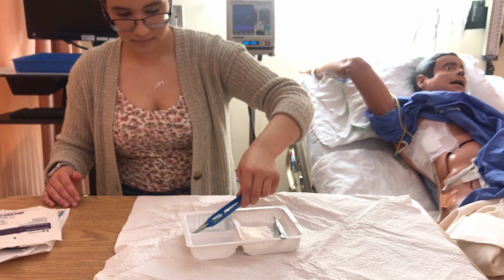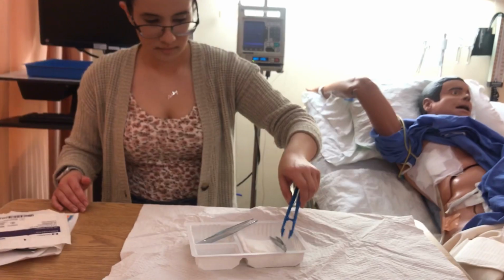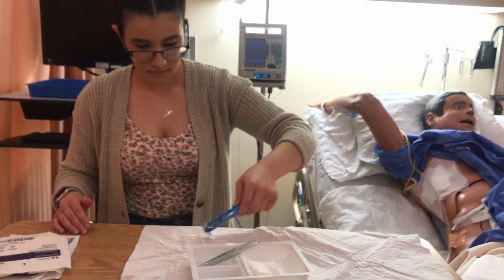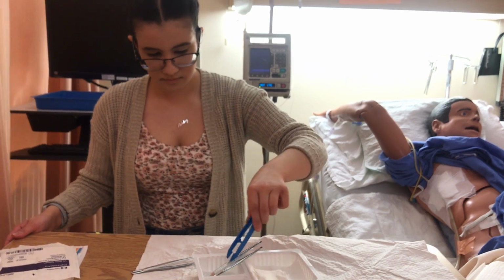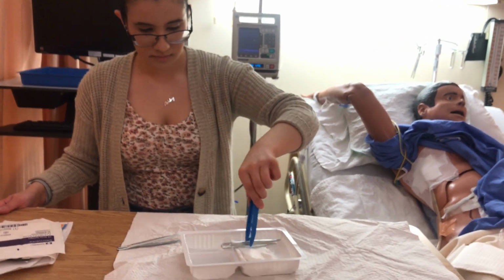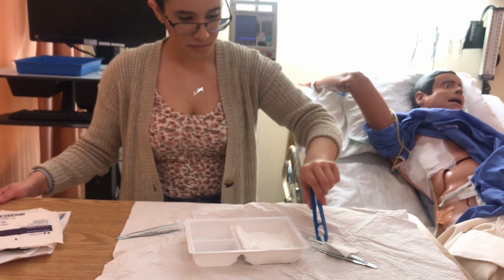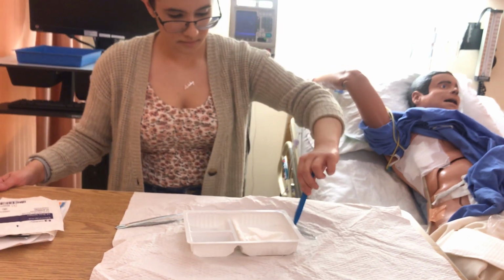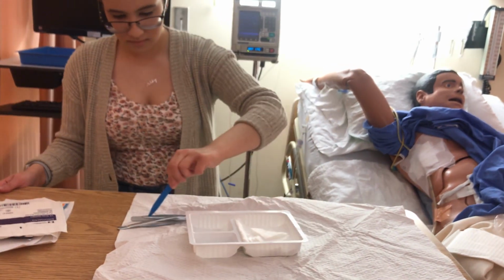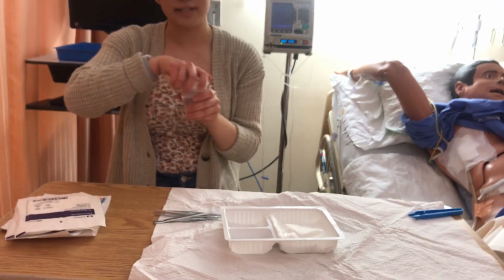We have to go relatively quickly. Okay, you starting over there? I checked all the time. I clamped it. Once you press it, we just hold it. Alright, ready? 3, 2, 1, go. And add my normal saline.